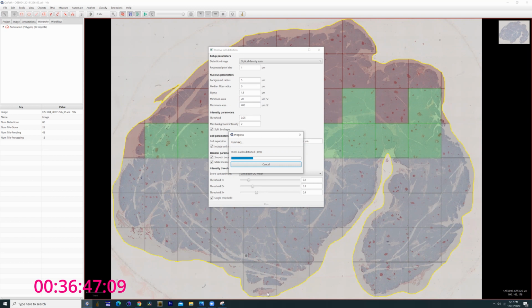These areas happen a lot in immunohistochemical staining, and I don't think these are actually islets down here. I think they're probably deposition of precipitant from the secondary. But anyway, I'll show you how we can try to clean some of that up, or whether it's even important in the big picture. One obvious thing you can do is try to clip it out in the beginning.